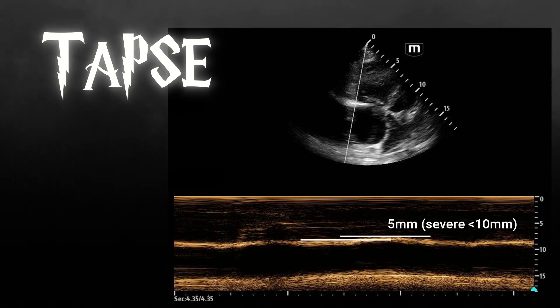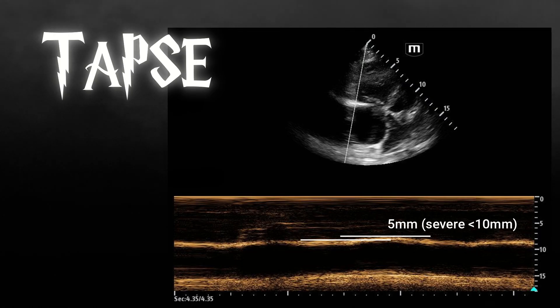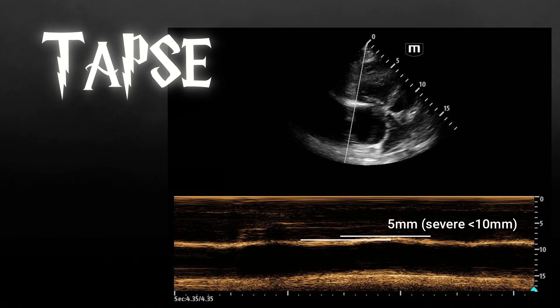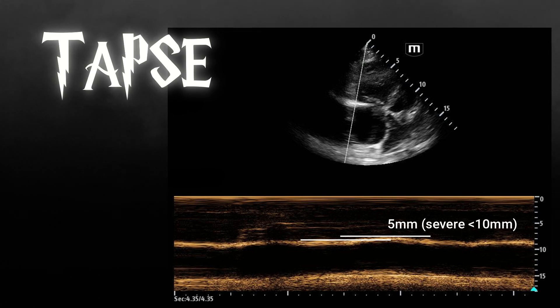You'll notice here when we measure it, it is only 5 millimeters. Anything under 10 millimeters is severely reduced, so we know this patient's RV function is severely reduced.